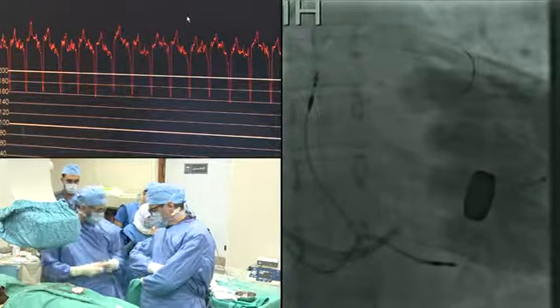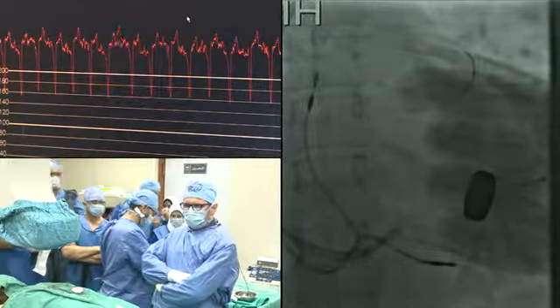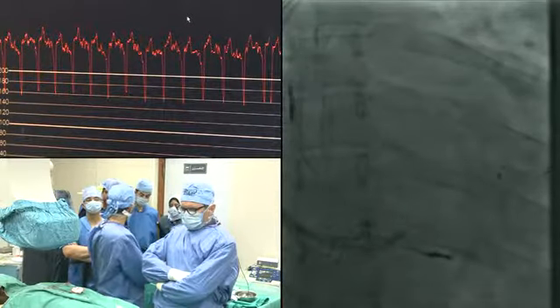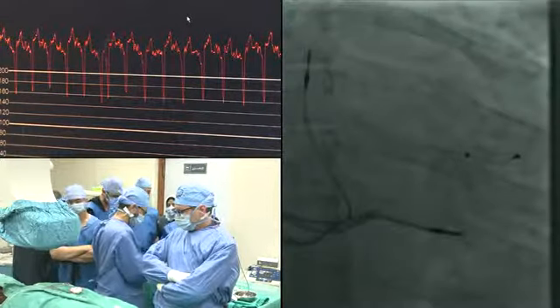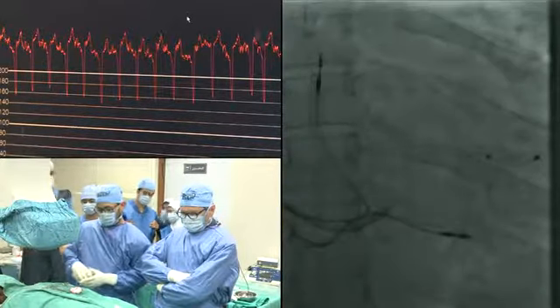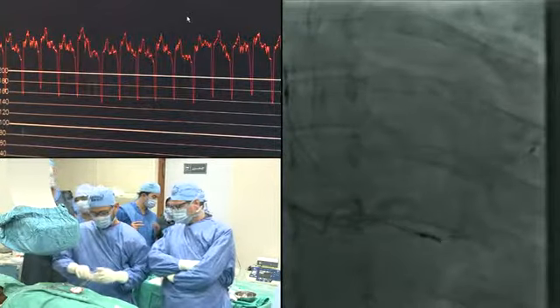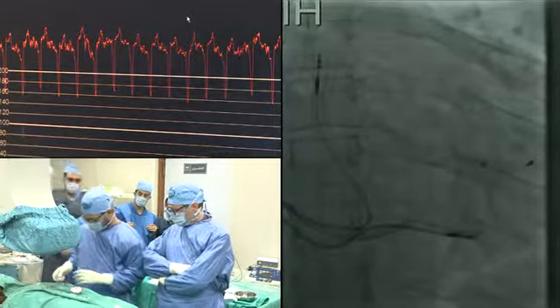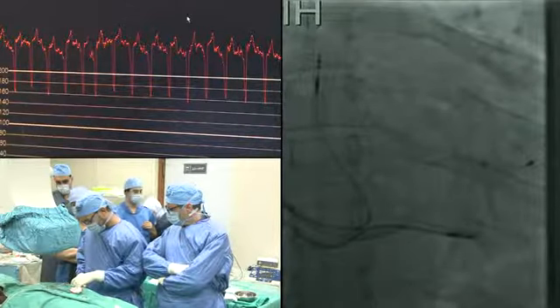Okay, the final step now, which is slitting. Yes, definitely, that's a very good point. Because of financial issues, definitely. This is the only reason. Because this patient is typically a CRT-D candidate and will do better for sure, but the financial issues may constrain us.